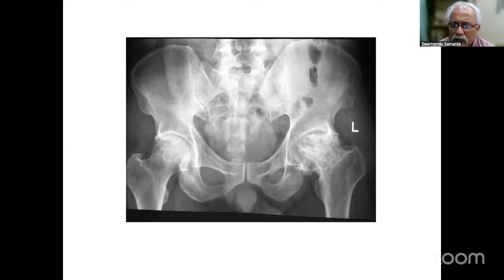So I think our purpose of taking the meeting was successful, that now you can explain how to present your X-ray in your Viva table, that this is the radiograph of the mature skeleton showing pelvis with both hips. Now you describe one by one what you are seeing in the femoral side, also in the acetabular side, and you just explain and stop there. Let the examiner ask you the diagnosis. Then once you diagnose, probably he will ask you about the scoring and the grading system.